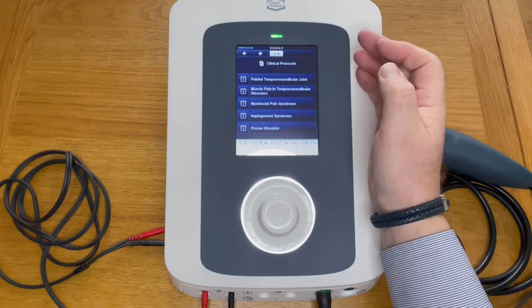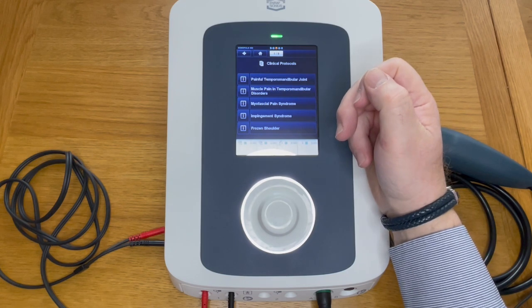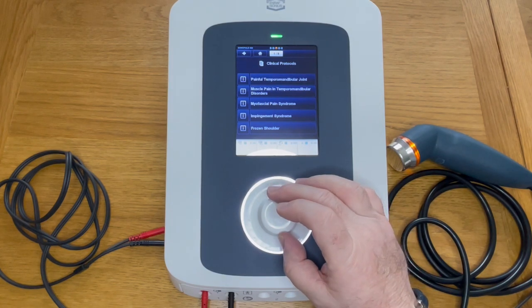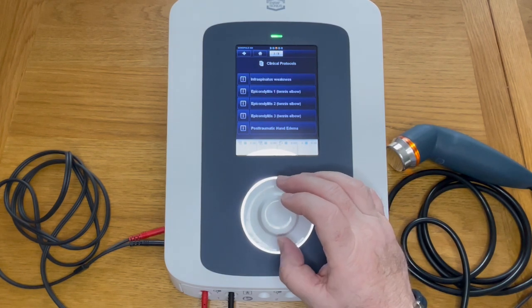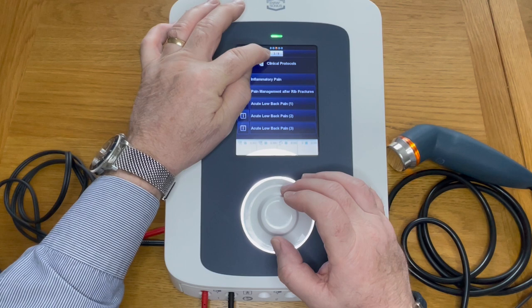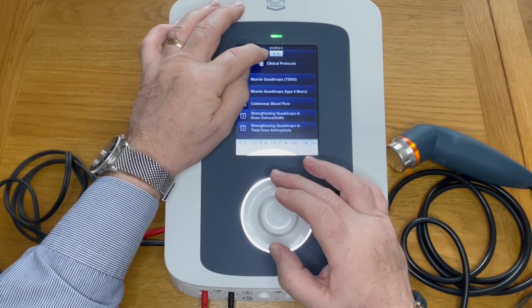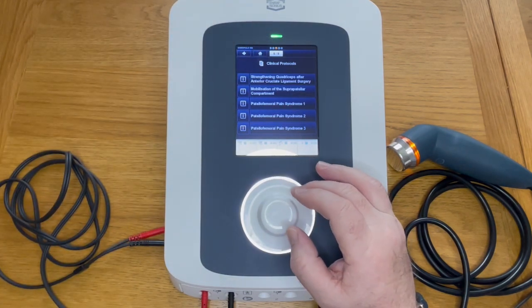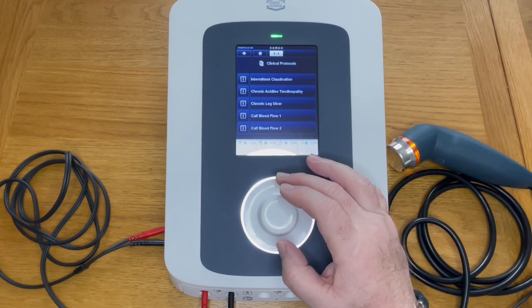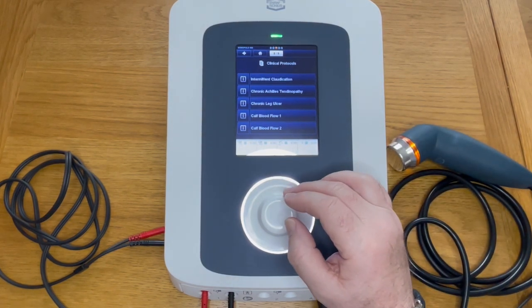If we look at clinical protocols, you can see the dial is lit up and ready to operate. On the left hand side, 'I' is for information. Here we have the different conditions we can treat, which are in the protocols. If we rotate the dial, it goes down through different pages — page three of nine, page four of nine, five of nine, and so on. Rotate until you find a condition you wish to treat.